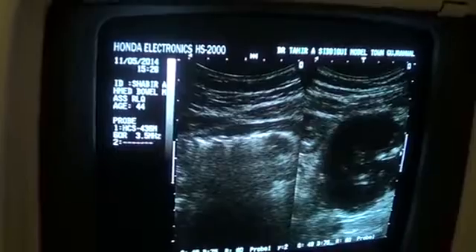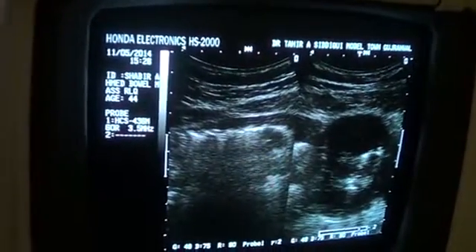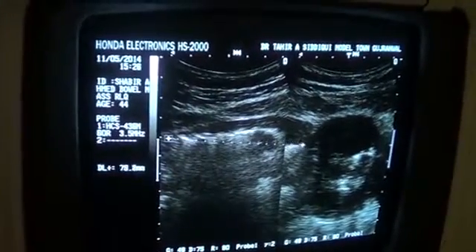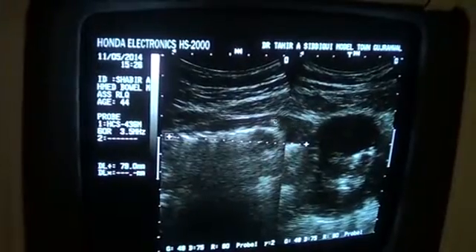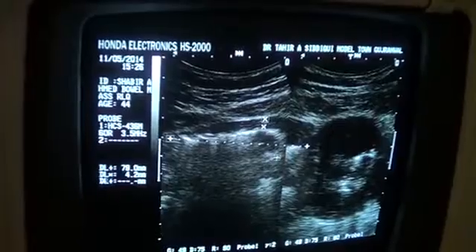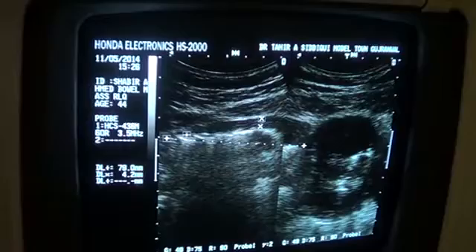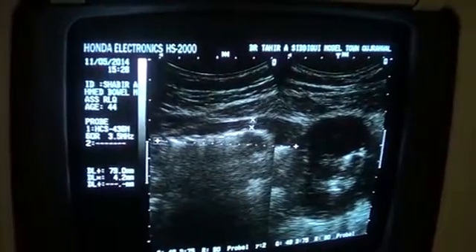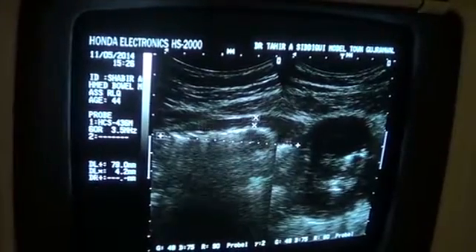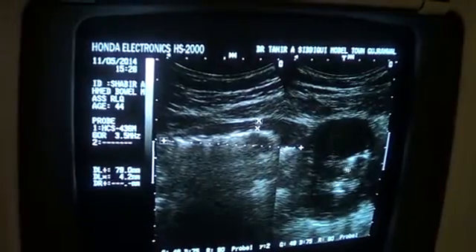Now you see that this is the part of the bowel that appears to be collapsed, and wall thickness we noted was about 4 millimeters, and this irregular broken echogenic area is the trapped air within the lumen of this bowel segment, which is related to the globular area of this bowel mass.